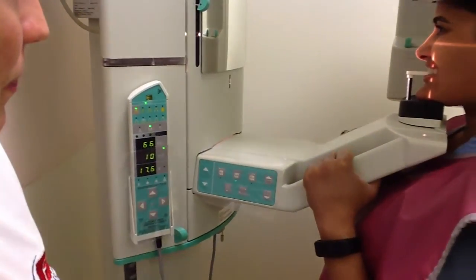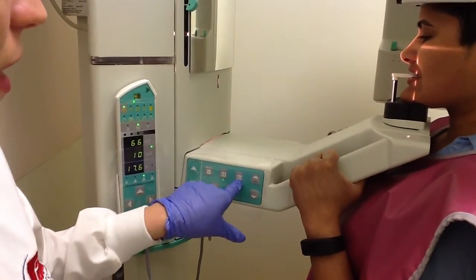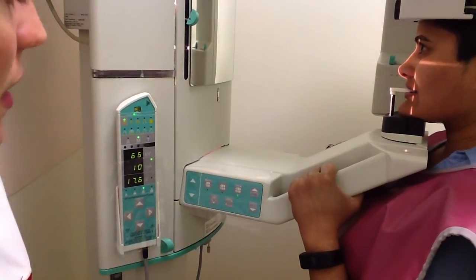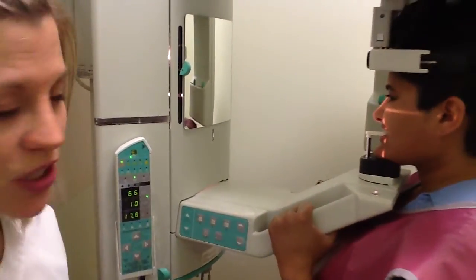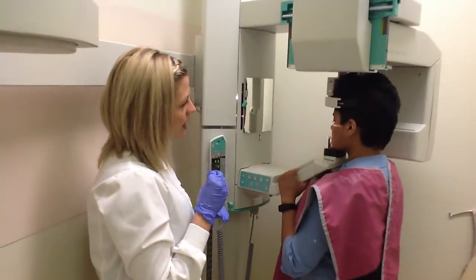So looking at Fareen here, I could see it's mesial of the 3. So I'm going to select the mesial button. So just as a review, here we have the mesial of the 3. This one is right on the 3, and this is distal of the 3. That's perfect.